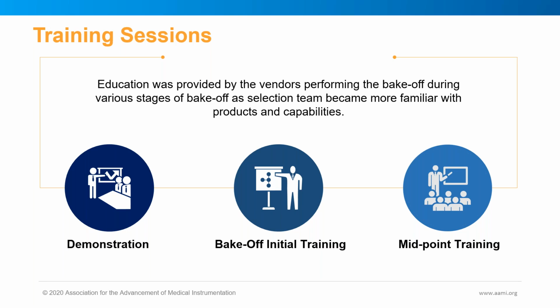Also with that, we were evaluating our systems during the bake-off. User friendliness was important because we wanted to get this out and get all of our clinical engineering staff using it. And, you know, we give them a lot of applications they work in, from their CMS system to our purchasing system to a number of other applications. We're adding one more application to the mix. So it was very important that we have a very user-friendly system for our staff to use. And having a vendor that's very supportive in adapting to your user-friendliness needs, as well as supporting with education, is a critical point in this.